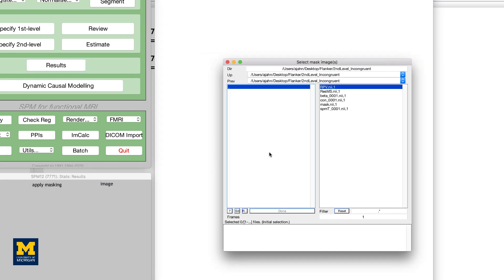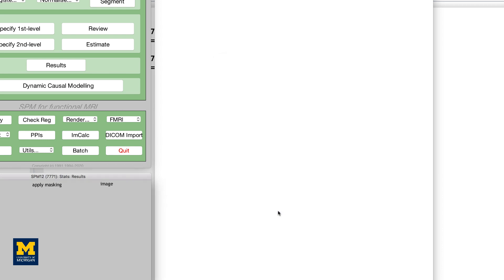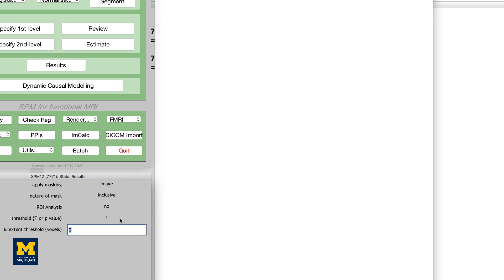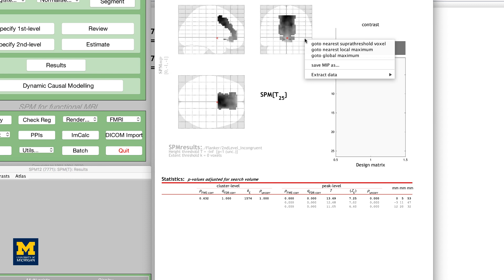Load the BA32 image you created using the Atlas toolbox, and choose Inclusive. This will restrict our analysis to the voxels inside the mask. Select No for ROI analysis, and None for the p-value adjustment. For the uncorrected p-value threshold, set the value to 1, and the extent threshold to 0. This threshold will show all the voxels in the mask that we selected.